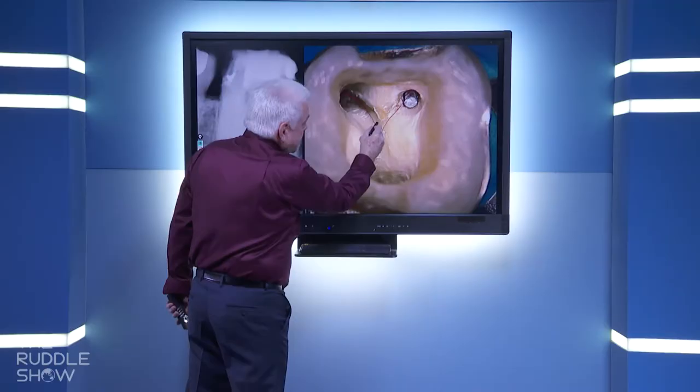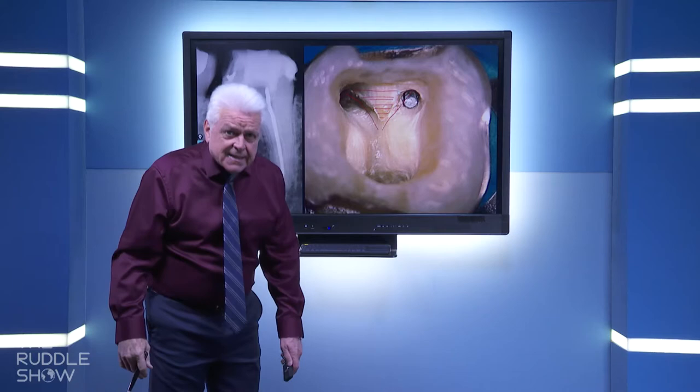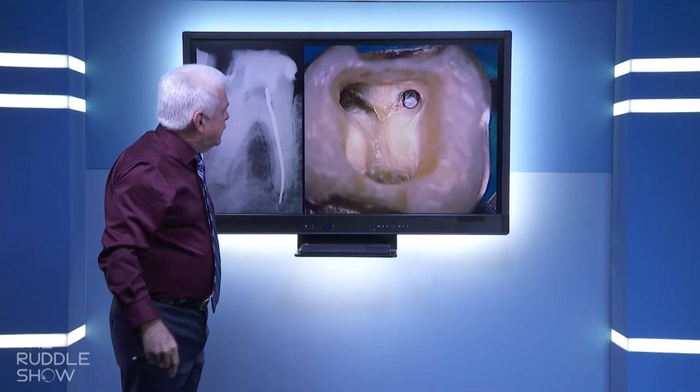That is a shelf of overlying dentin. That's pulpal roof. This is all pulpal roof. So if I can take that off with ultrasonics, okay, and I take that off, I can actually make the silver point appear to be longer. So instead of it being like this, now it's like that. So I have a bigger handle, a longer handle to grab.